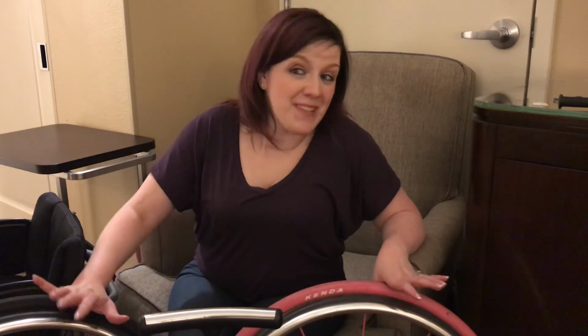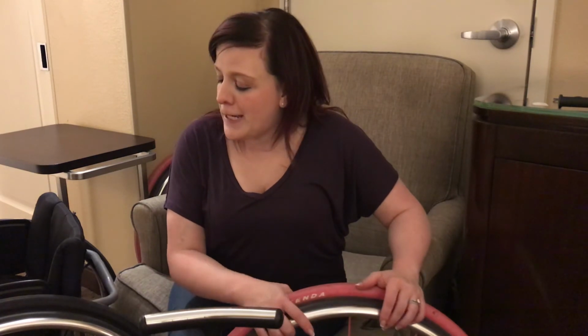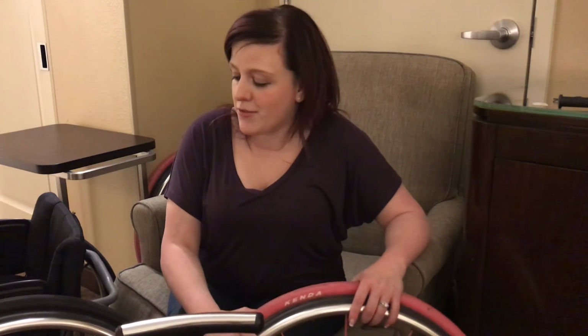So, okay, this took about an hour because I've never done it before. I had no idea what I was really doing. I mean, I've seen it done before, but I've never actually done it myself. So again, learning experience, it's life. So I will say, like I mentioned before, there are advantages and disadvantages of both. You just saw one of the disadvantages of having a flat tire. This had a tube in it, and it had to be replaced, and so it took a while to replace it. This tire is solid, so it doesn't even need air.